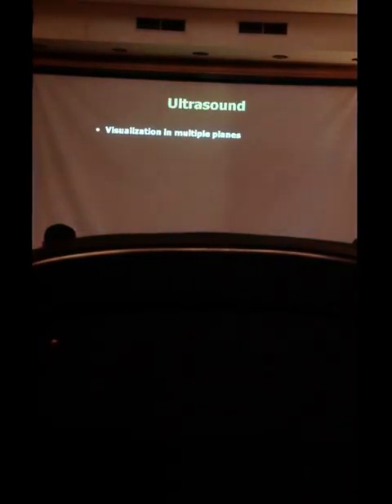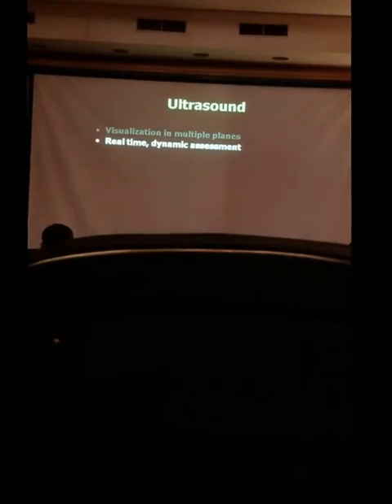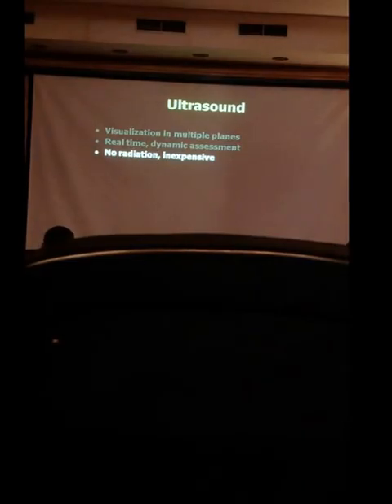So let's talk a bit about ultrasound. Ultrasound is being used to assess cartilage, which I personally don't think is a good idea. There is some data in the literature showing that it's okay. I will show you some facts, and then you decide for yourselves what you think about ultrasound. It allows visualization in multiple planes. It's a real-time exam and allows for dynamic assessment. This is, of course, an advantage compared to any other imaging method, especially compared to MRI and CT. There is no radiation involved and it's inexpensive. It's widely available. So these are the advantages of ultrasound.